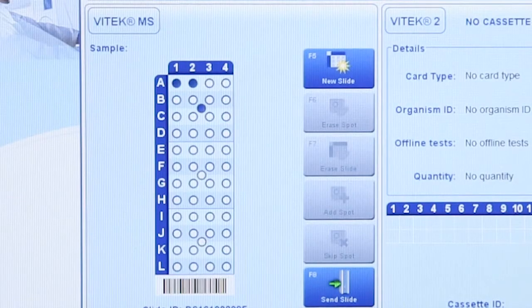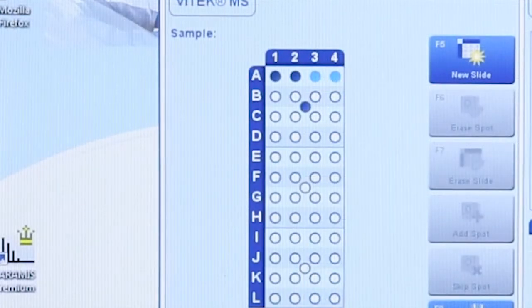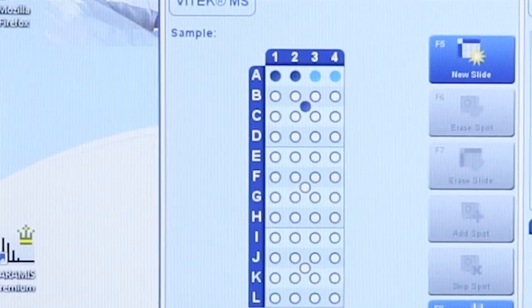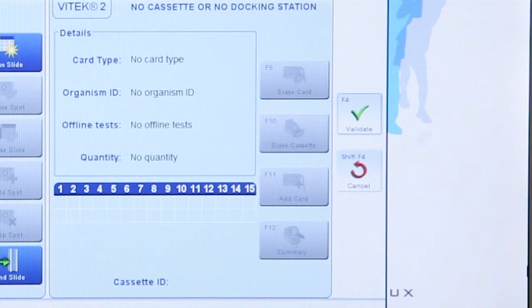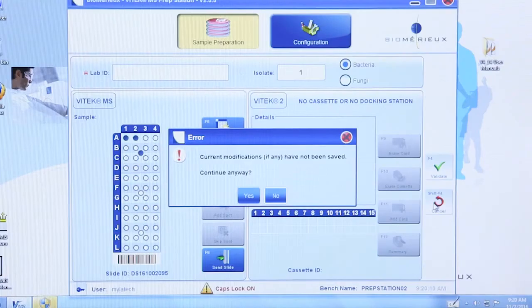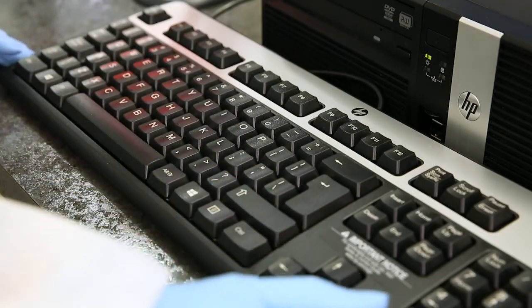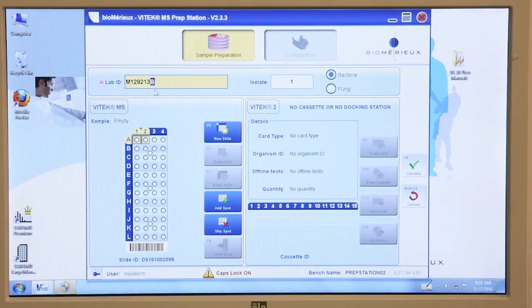Once validated, dark blue spots indicate a bacterial sample, and light blue spots indicate a yeast or fungal isolate. To reject the sample information, click the Cancel button or press Shift plus F4. Confirm by clicking Yes, then re-enter the correct information and validate as above.